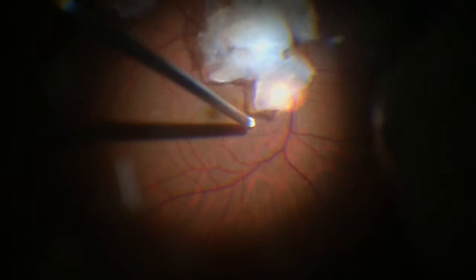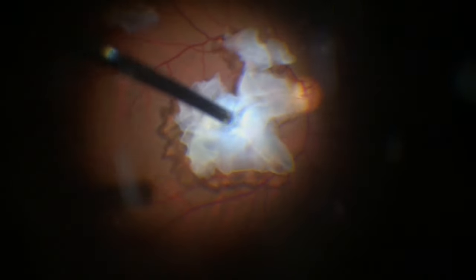The light pipe can be used to lacerate the lens so as to create smaller pieces which are easier to consume.